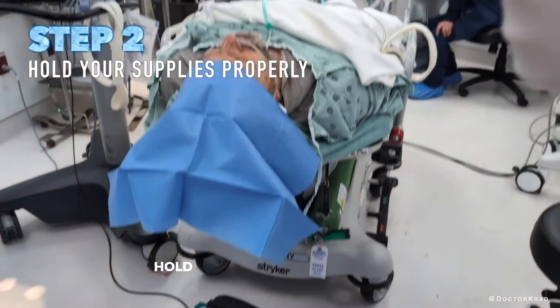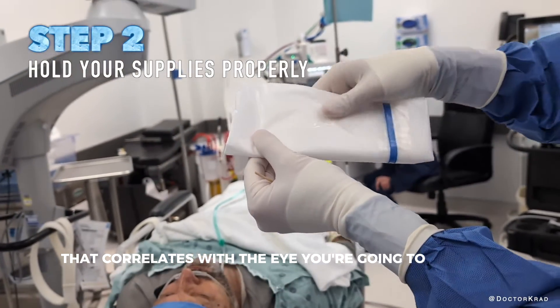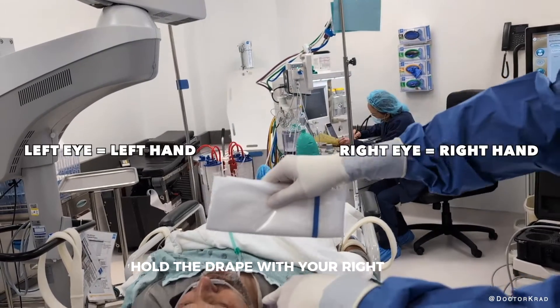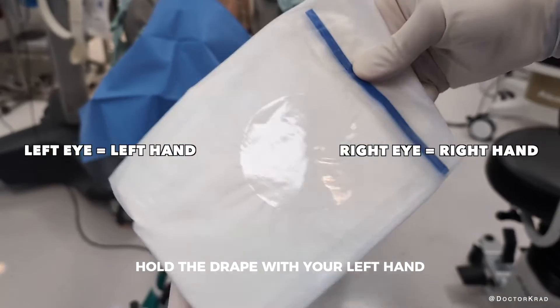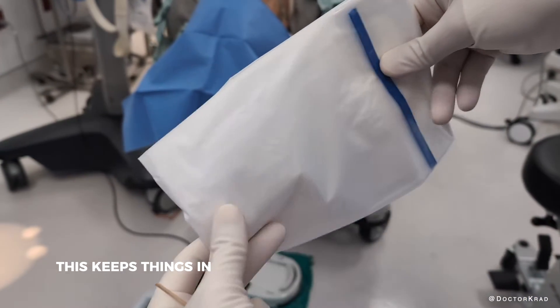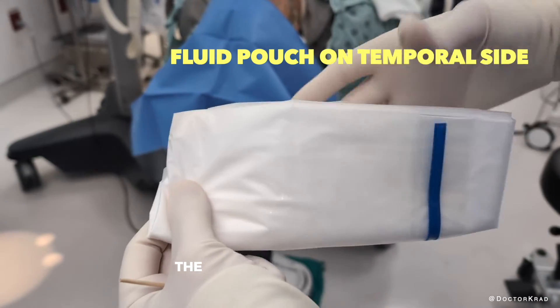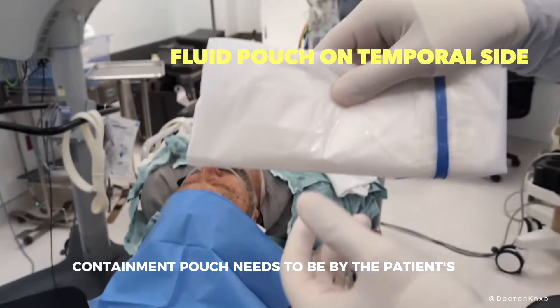Step two: hold the drape with your hand that correlates with the eye you're going to operate on. If you're operating on the right eye, hold the drape with your right hand. If it's a left eye surgery, hold the drape with your left hand. This keeps things in order during the hustle and bustle of your surgery day. The blue band of the fluid containment pouch needs to be by the patient's ear.